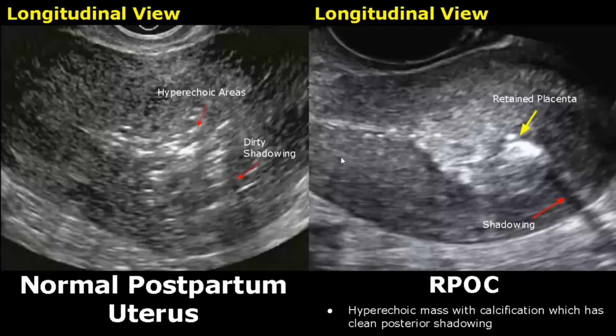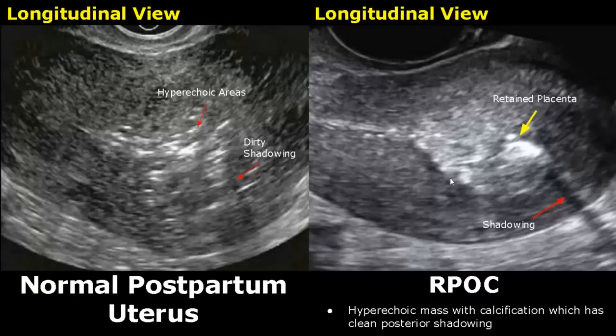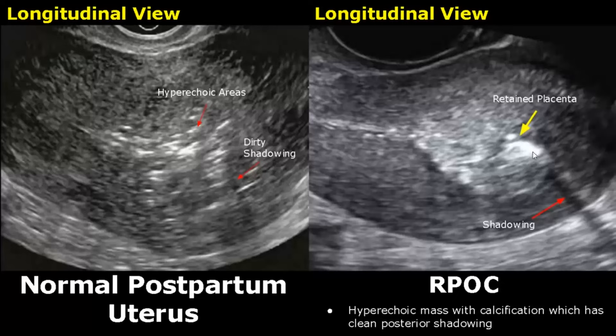These are transvaginal views of postpartum uterus and RPOC. Here we see some hyperechoic areas with dirty shadowing, meaning air is present — this is a normal appearance. In this case of RPOC, there is a hyperechoic mass with calcification. This clean black shadowing confirms calcification, and calcified areas indicate a retained placenta, which is helpful in diagnosis.